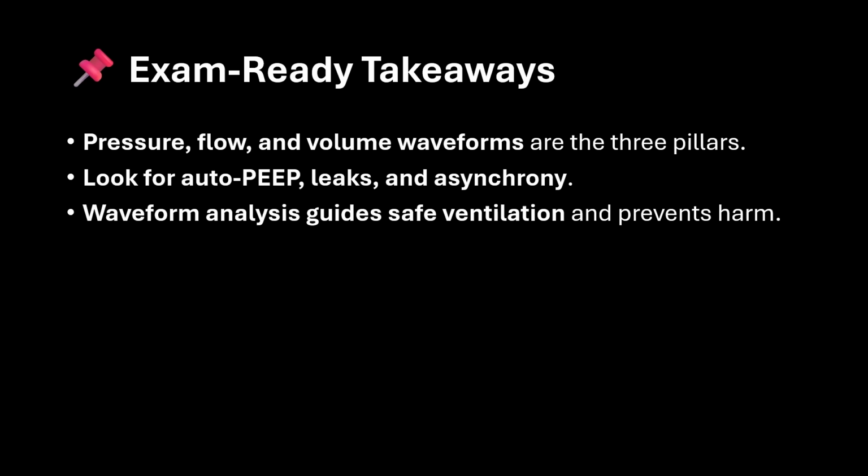The loops are also very important. And let me tell you, the more you read about the graphics and scalars and loops, etc., the more you will become confused and easily you will forget. So my suggestion is that you should be looking at the ventilator graphs very frequently and try to analyze the pattern. Take a picture when you are at the bedside. You all have smartphones, so don't hesitate, take a picture and try to discuss the waveforms with your colleagues, your seniors, your mentors, your teachers, everybody. So try to do that and try to learn everything yourself. It's not that big a deal.